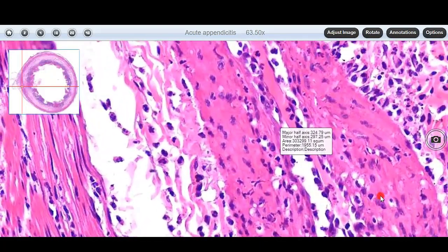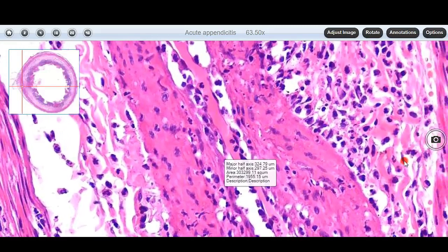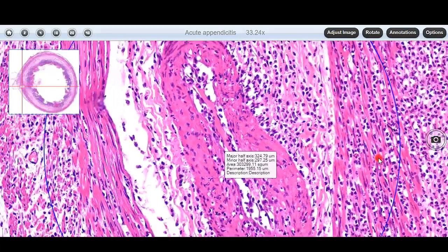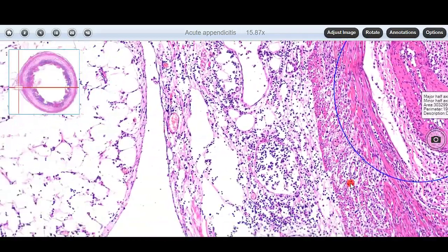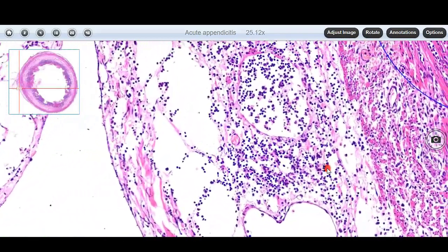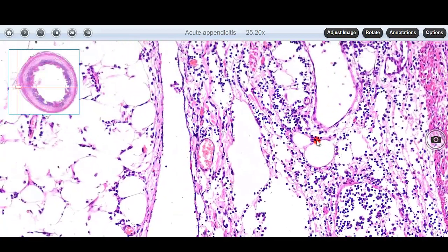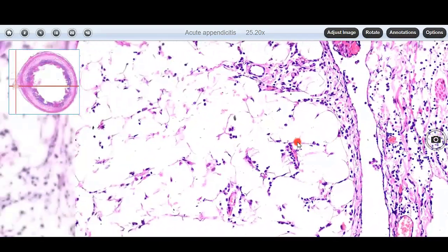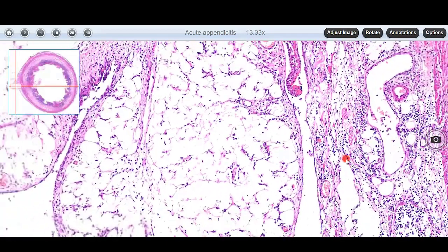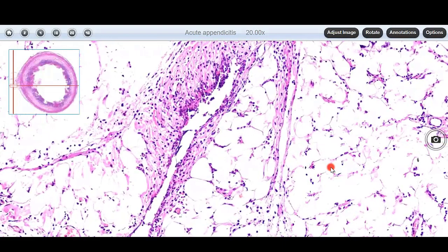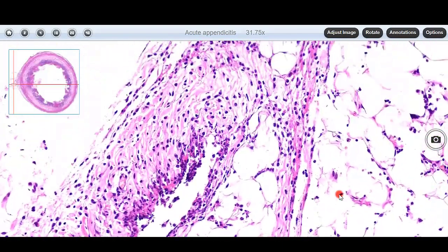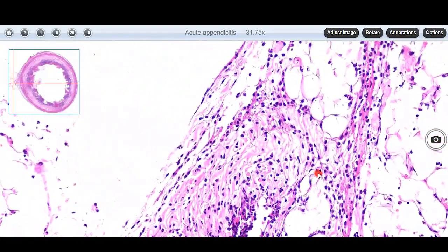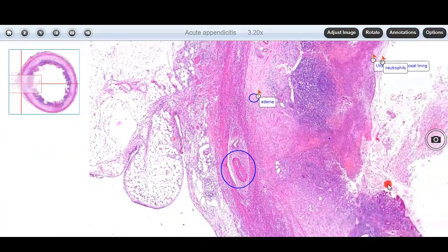This is the blood vessel, then cells, and then they are crossing on to the surrounding tissue. The inflammation is also in the serosa layer and in the surrounding peri-appendiceal fat. These are adipocytes and we can see they are surrounded by neutrophils.